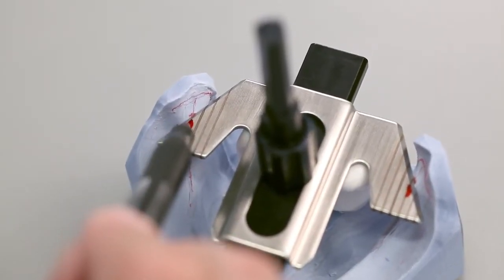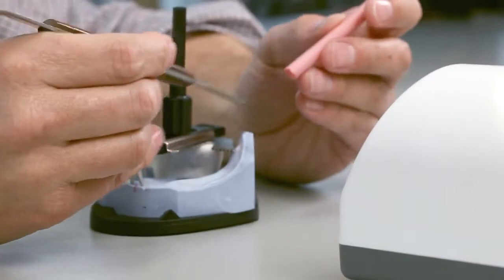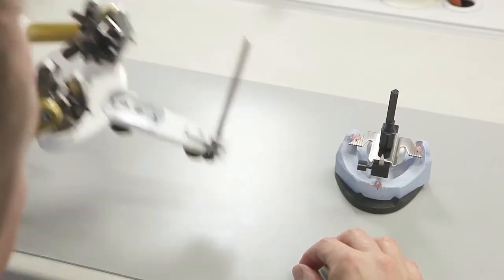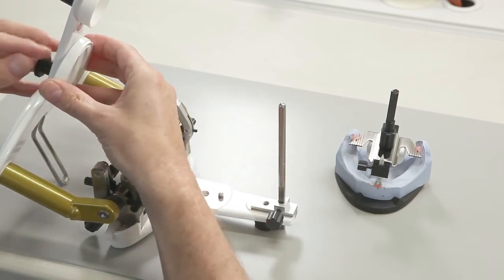Symmetrically align the line system with the alveolar ridge. Once you have reached the correct position, secure the horizontal guide on the model using sticky wax. Now the model can be mounted in the articulator. Screw the base plate for the lower jaw in place.